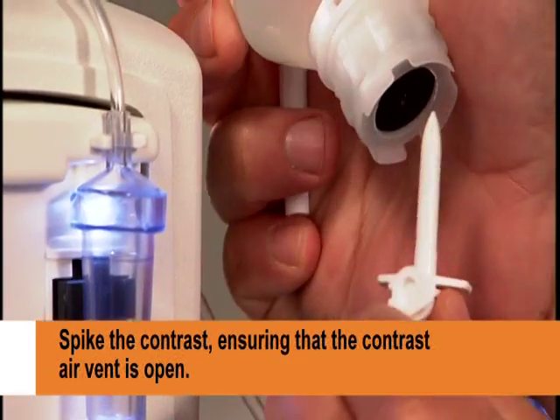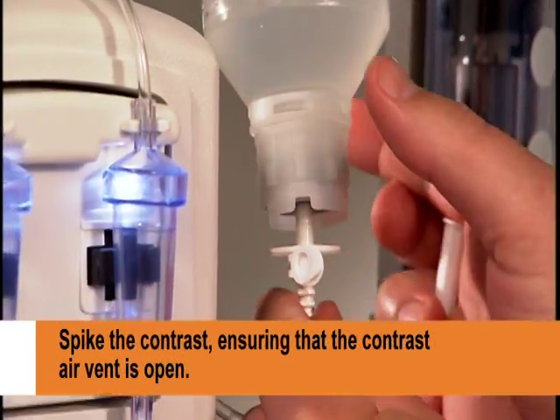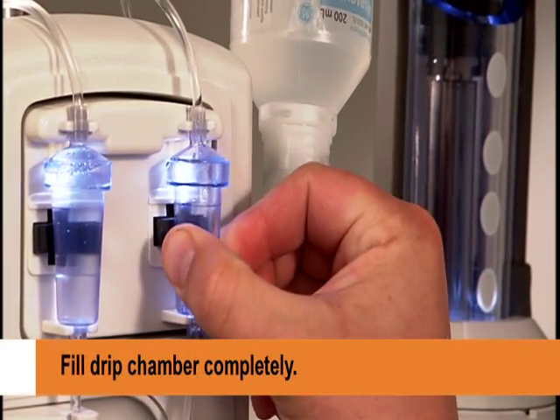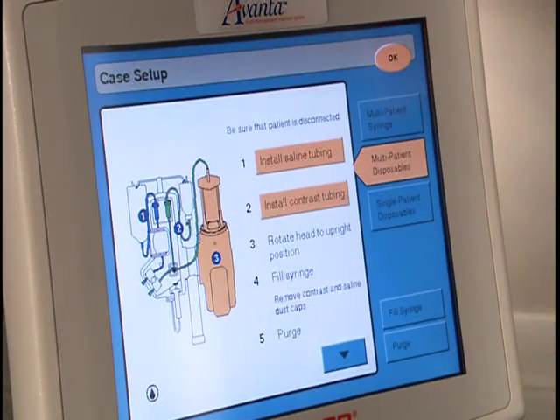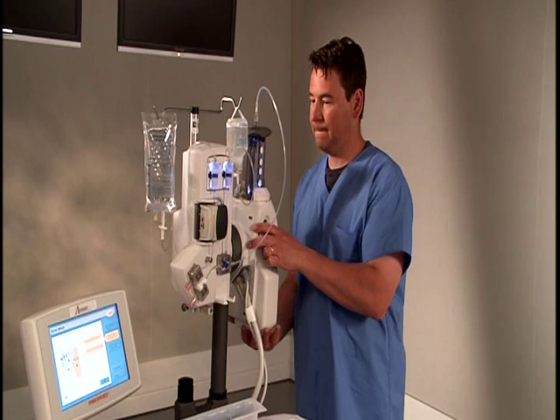Step 5. Spike the contrast, ensuring that the contrast air vent is open. Step 6. Fill the contrast drip chamber completely. Then touch Complete. Next, complete Step 3 and confirm that the injector head is in the upright position.